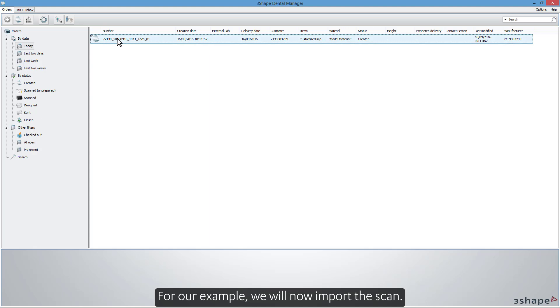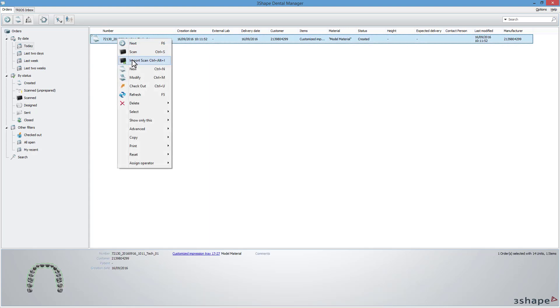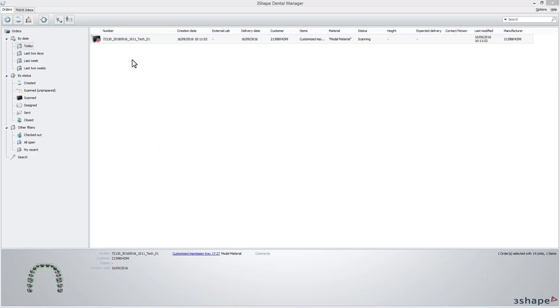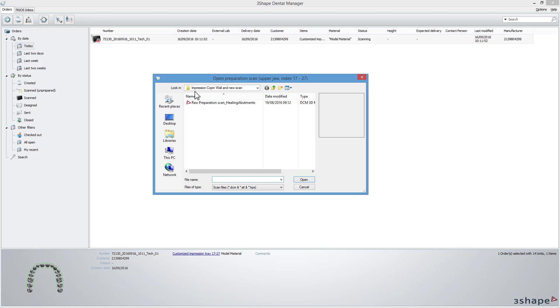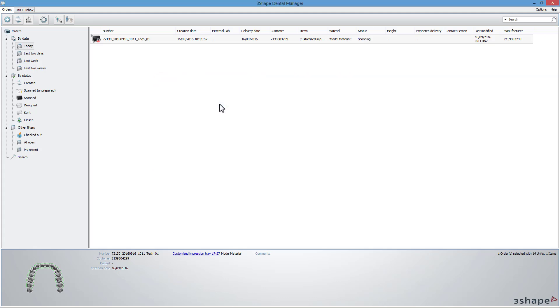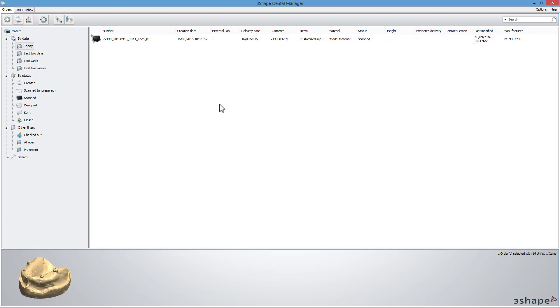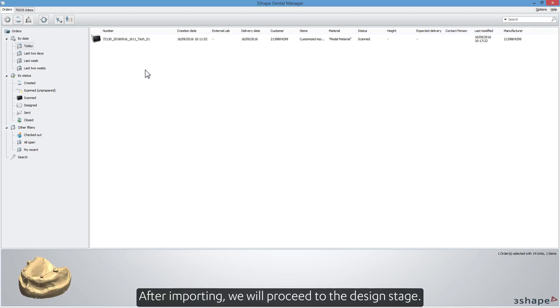or OK if you have already scanned an impression. For our example, we will now import the scan. After importing, we will proceed to the design stage.